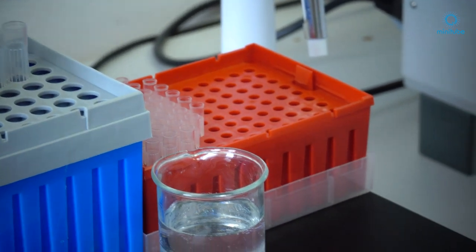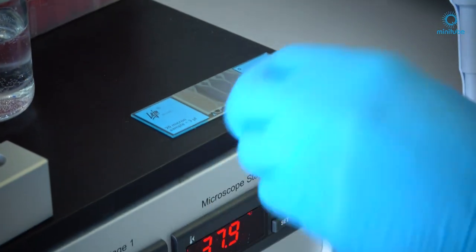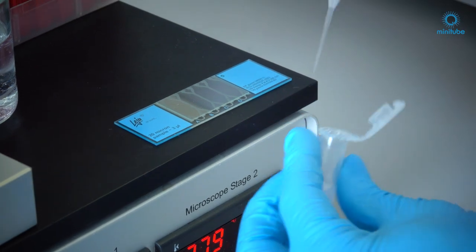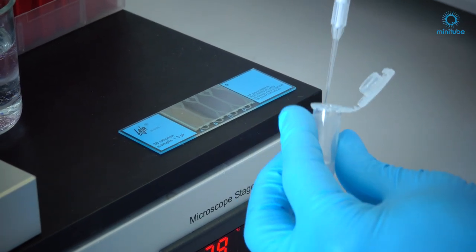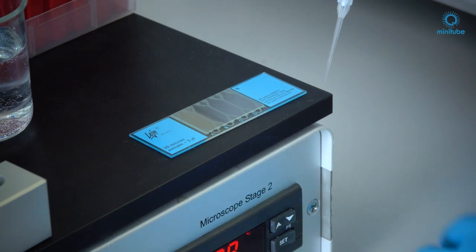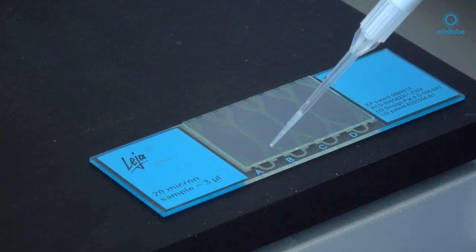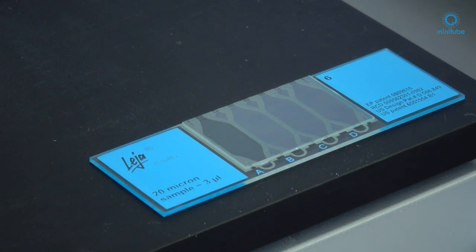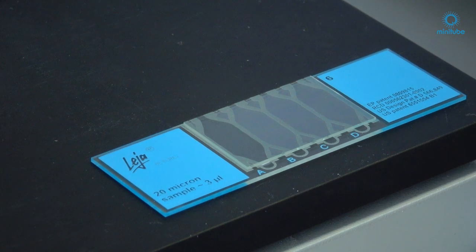Take the tip, mix the prepared sample. Take the 2.7 microliters. To fill the counting chamber, you push the droplet to the front of the tip and fill the chamber in one working step.